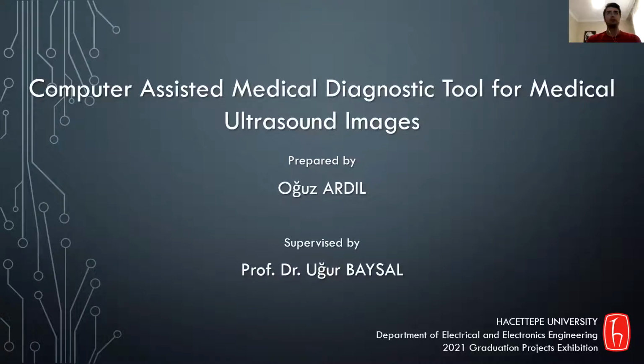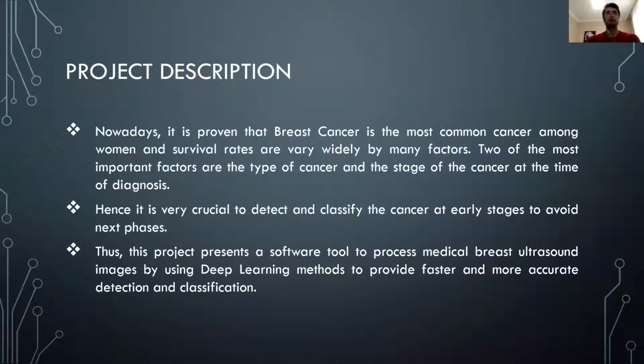Hello, this is Oğuz, and in this video I will present my graduation project called Computer-Assisted Medical Diagnostic Tool for Medical Ultrasound Images. The project is supervised by Professor Dr. Uğur BAYSAL.